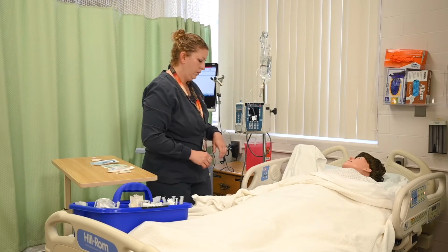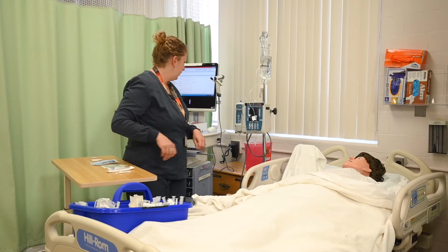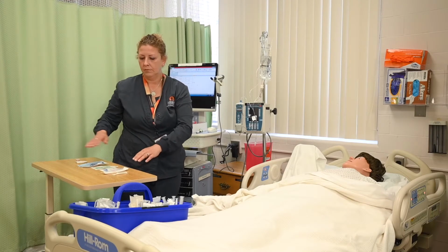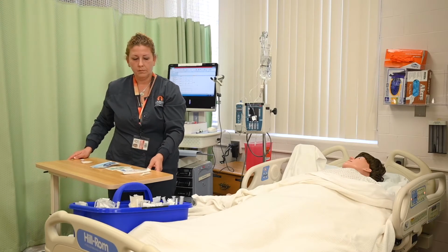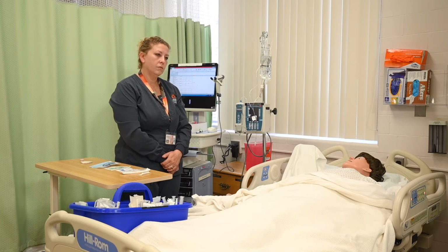If Sarah was unable to find a suitable vein, she could try some different strategies, such as placing the extremity in a dependent position. She could apply warmth to the extremity for several minutes with a warm compress. Also palpate the vein with the index finger by pressing downward and noting the resilience and bounciness of the vein.